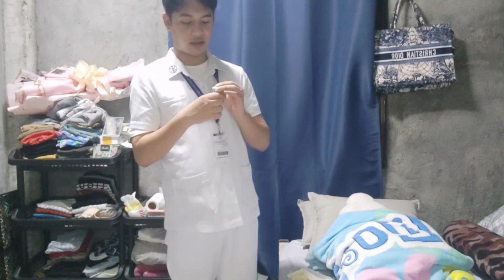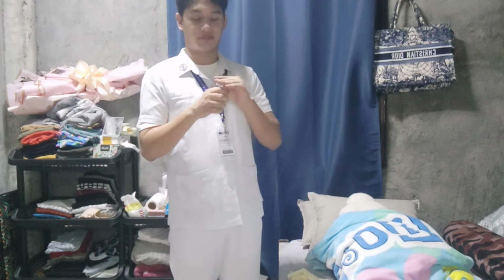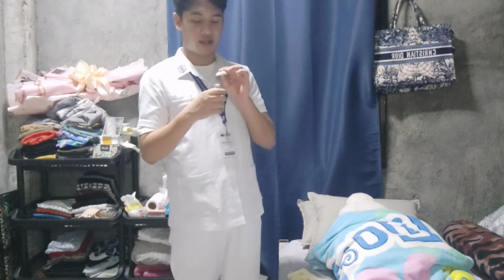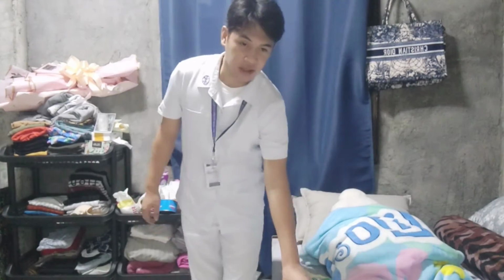This is to keep the needle sterile and to deter the microorganisms that may harbor on the lid of the vial. Then next, we're going to withdraw the medication.